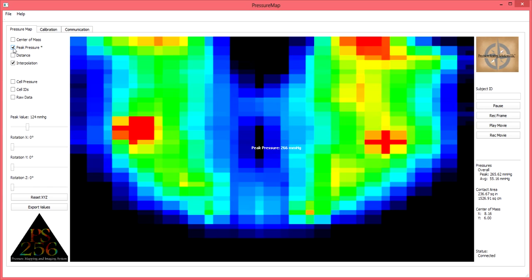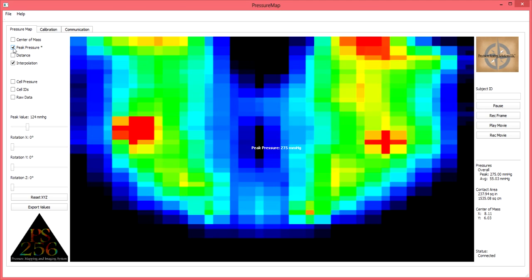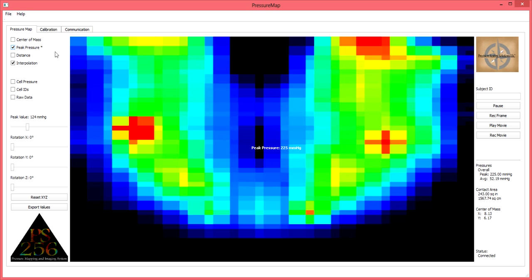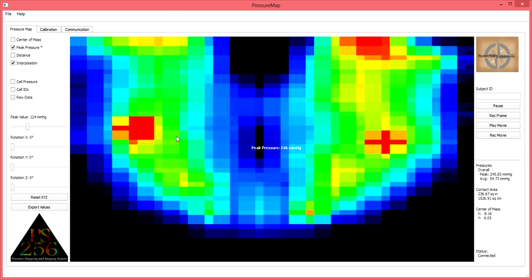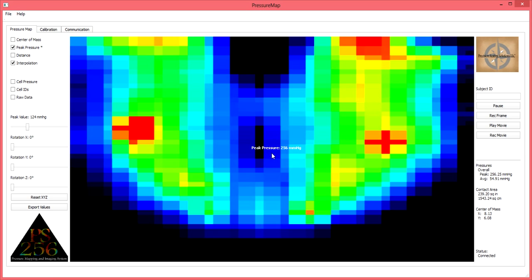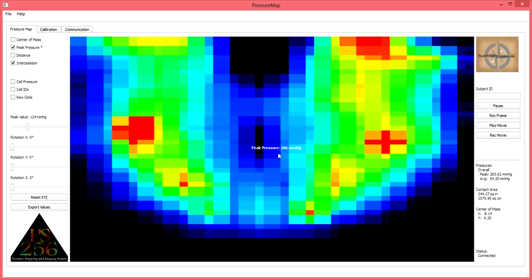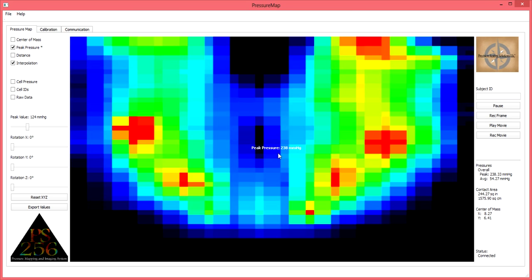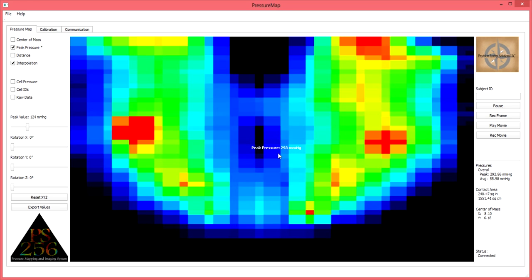When this feature is selected, you will first see a peak pressure display in the center of the mat with the reading in mmHg. This display is indicating the amount of peak pressure being identified at any point on the mat and is continually updated via live feed.